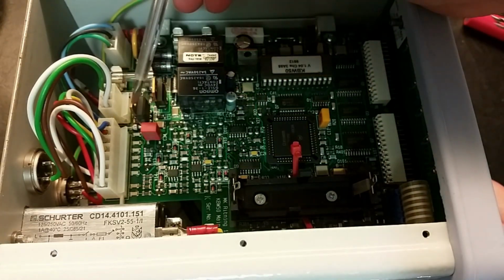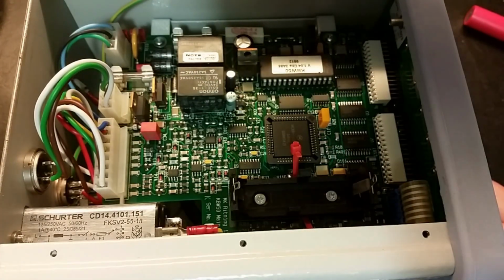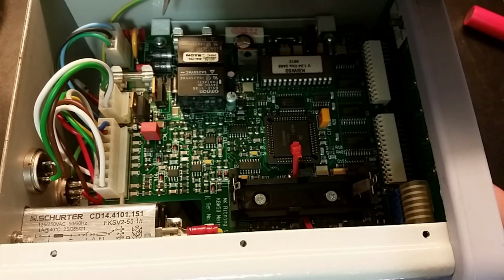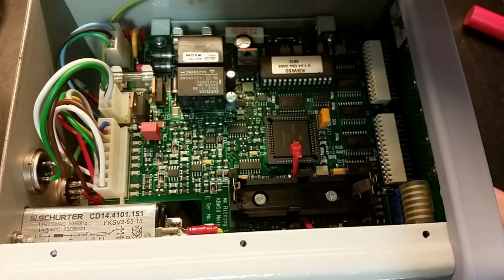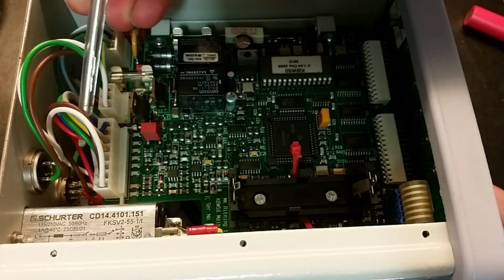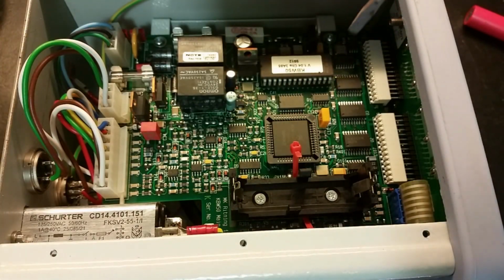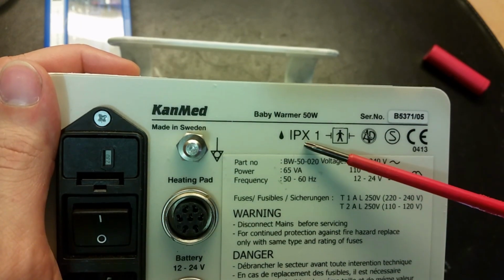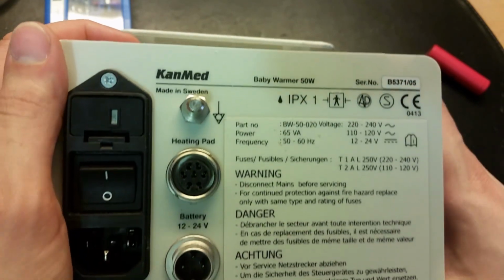We'll have to take it to bits. We got 2 that look like transistors here. The wire goes to this battery 12 volt, 24 volt connector. We got, I think that's a power intake from the transformer. We got a double diode rectification, so it's maybe a center tapped transformer. With a fuse, we got a shunt resistor here, and this big connector here goes to the heater. And underneath here we got a large toroidal transformer. Yes, I almost missed it. Made in Sweden, and the IP class IPX1, and this is the medical sign that's safe for human use.